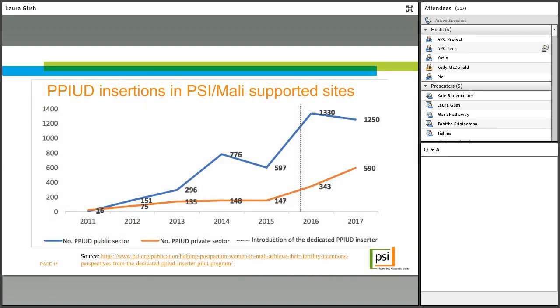Here's some quick data from the time the dedicated inserter was introduced in 2016. We've seen a significant increase in the number of PPIUDs provided in both public and private sector. If you want to learn more, there is a case study about this on PSI's website.